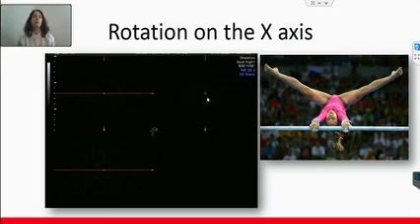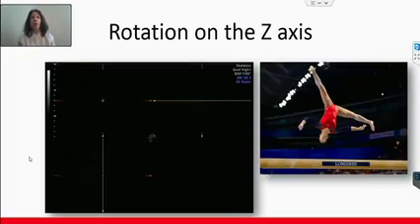This circle here is the Z-axis rotation. Okay, if we look at her from this side. And if we want to understand what happens when we do the Z-axis rotation, just think about a gymnast doing a cartwheel. So if we look at her from the A plane, we see only her coronal plane rotating. But if we look from this side, we will see her axial plane or sagittal plane. And when we look from below, we will also see either the axial or sagittal planes.